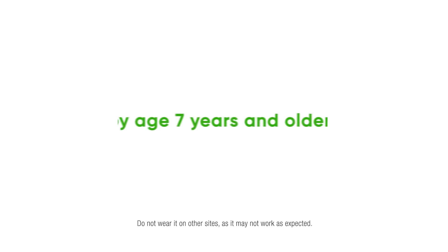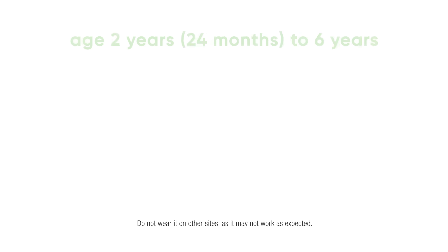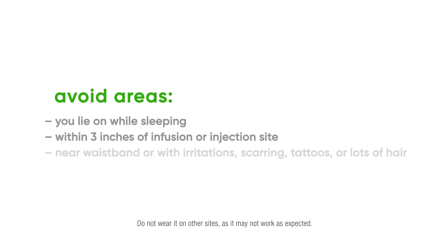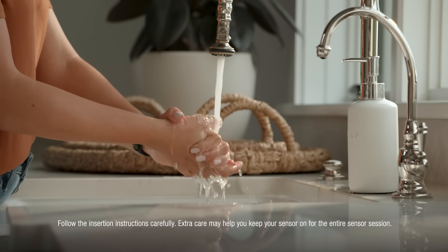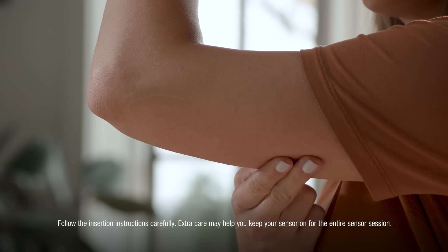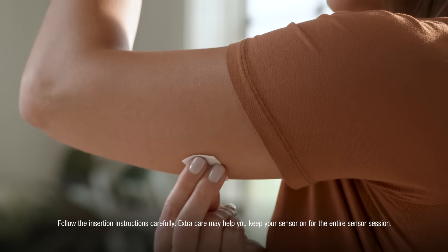To insert your sensor, first choose your sensor site. Before you begin, wash and dry your hands. Choose a site on the back of the upper arm with enough fat to avoid muscle, in a site that is not likely to be bumped or pushed. Clean your site with an alcohol wipe and let it dry for at least 10 seconds.